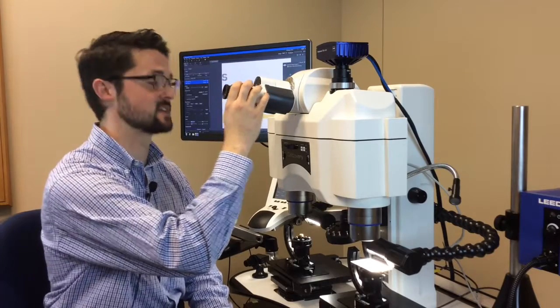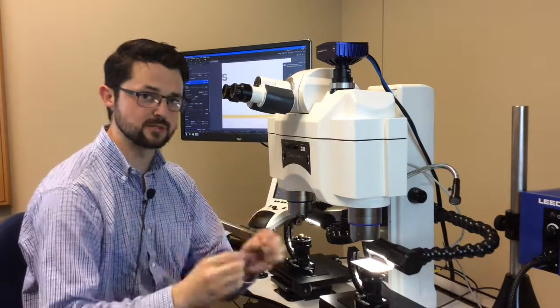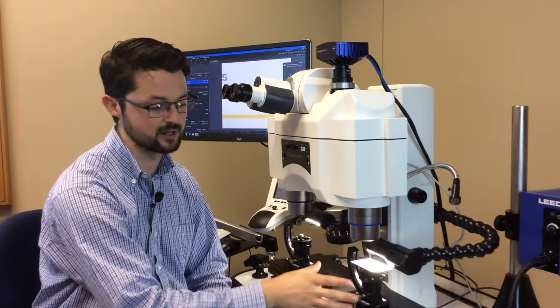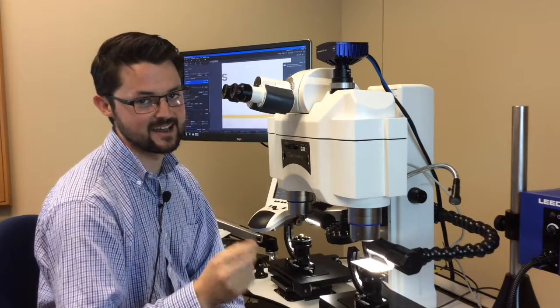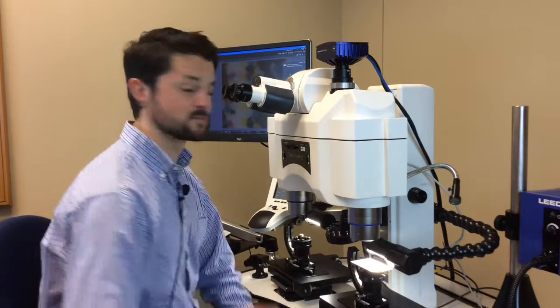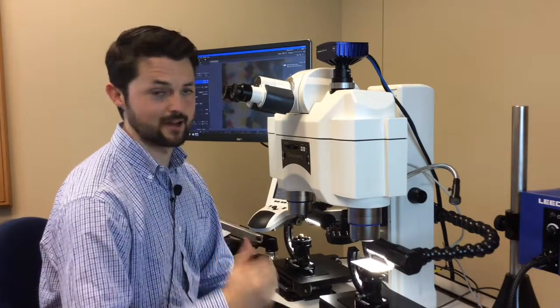I'm going to do it for my right eye as well as my left eye. The next thing I'm going to do is zoom in all the way on a flat specimen, such as a business card, and bring the image into focus. But to do that, I'm first going to need to take off my glasses. Now that I'm zoomed in all the way, I'll bring the image into focus. And now I'm going to zoom back out.